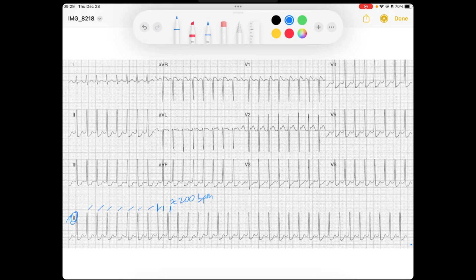The first things that come to mind when I see a QRS moving that fast is it's likely not sinus. The sinus node is typically unable to sustain 200 beats per minute in the typical adult. Given the clinical scenario, think about what is the capability of the sinus node.